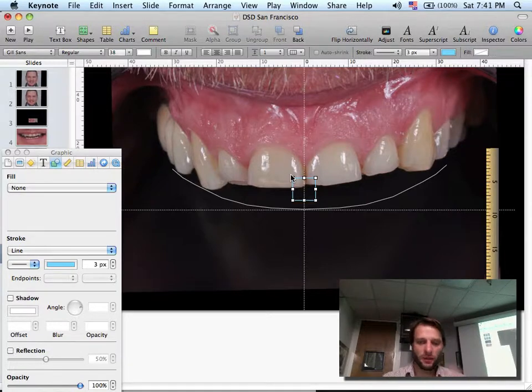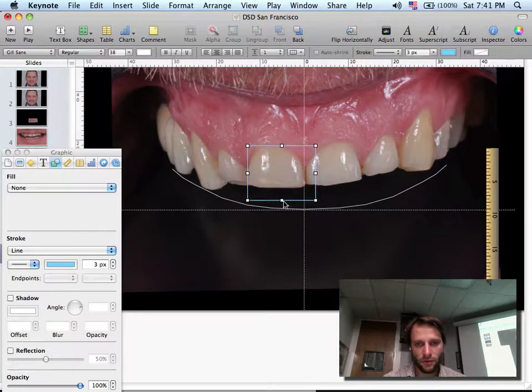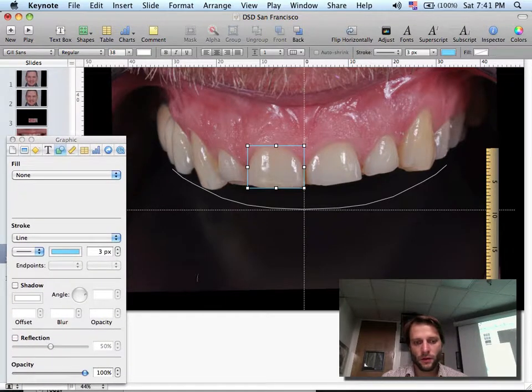Now to measure the proportion, I have to bring this square and make the square touch all the sides of the central that I want to measure. So let's measure first the right central. So touching the zenith here, gingival margin, touching the distal, touching the incisal edge, touch here better, here, and touching the midline, the mesial. Okay. Once I do that, I can click.